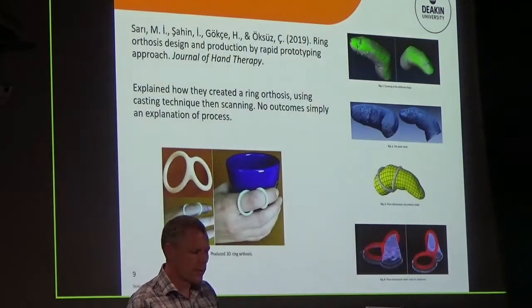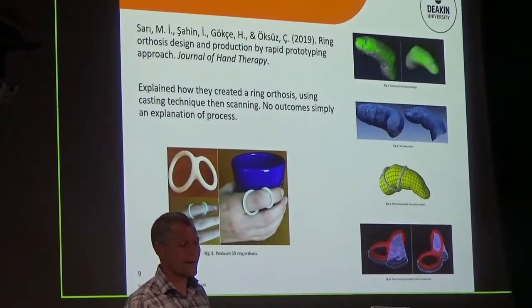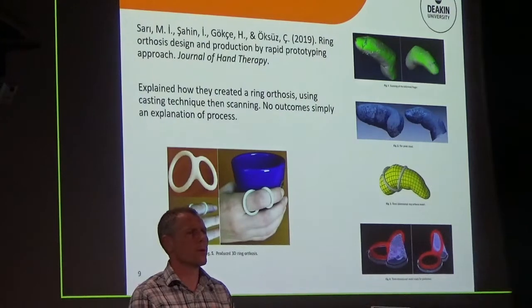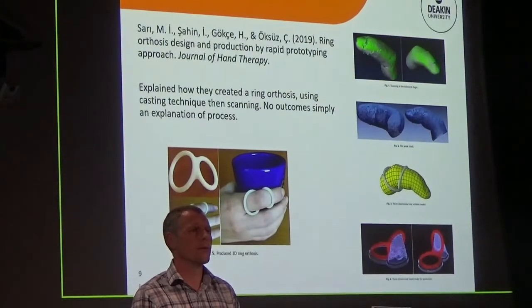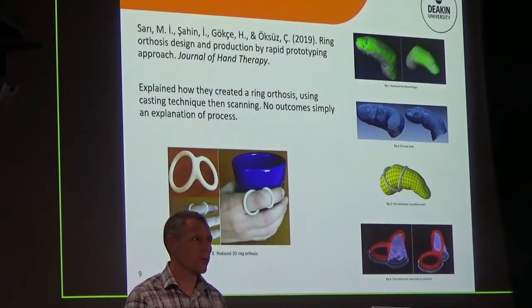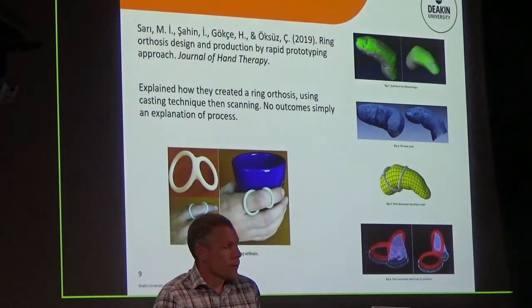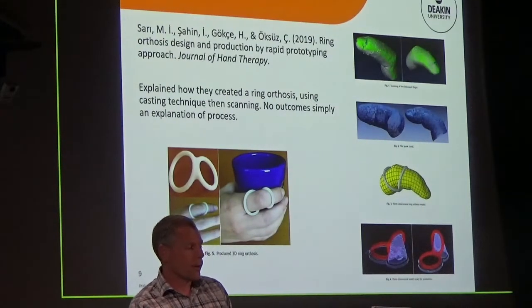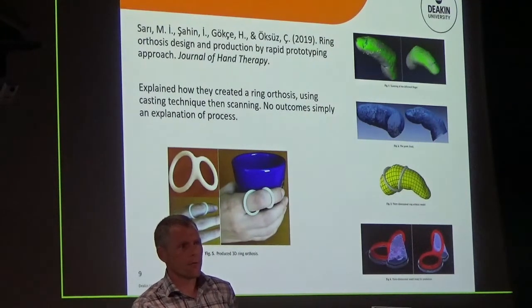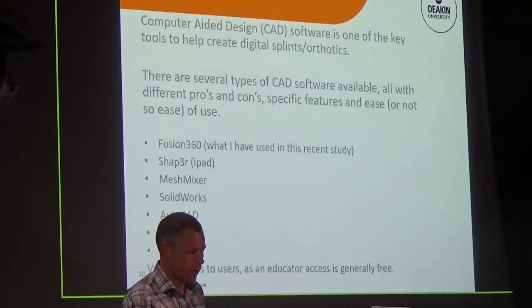This was a figure of 8 splint, sort of similar to what we've researched, but they did it through a means of actually plastering or casting the finger and then scanning that and applying the scan process through the computer software to create a splint. I'm not sure why they did the casting process, but they did, and they created a figure of 8 splint. So again, that was actually published in the Hand Therapy Journal. Interesting bit of research. So this just shows the variety of research that's out there for additive manufacturing and 3D printing. It's not just Loughborough Uni being one of the main people out there a few years back from sort of 2016. That's not just them anymore. There's lots of people throwing their hat into the ring, which is a good thing, I think.